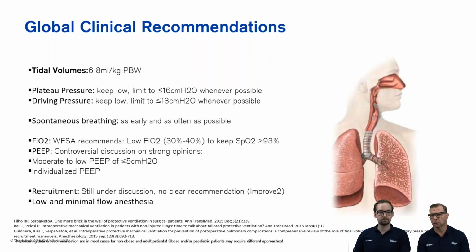Recruitment is obviously still under discussion. It's obviously not something yet that's accepted as being required in every single patient, and there's certainly no recommendation that every patient should have some form of recruitment. But there's a lot of data coming out, and there's a lot of study and research going into proving the validation of PEEP and the iPROVE 2 trial, which we expect to come out quite soon. If it's not already done, we'll actually look into recruitment manoeuvres a little bit more deeply.